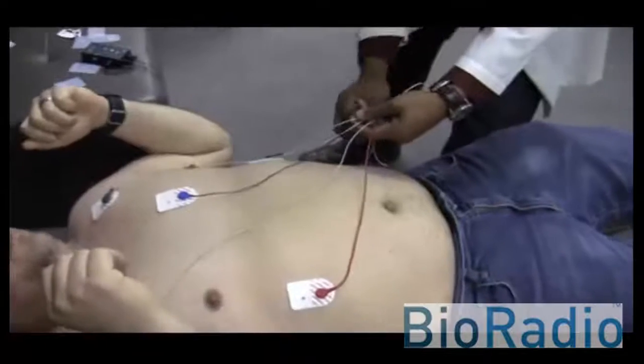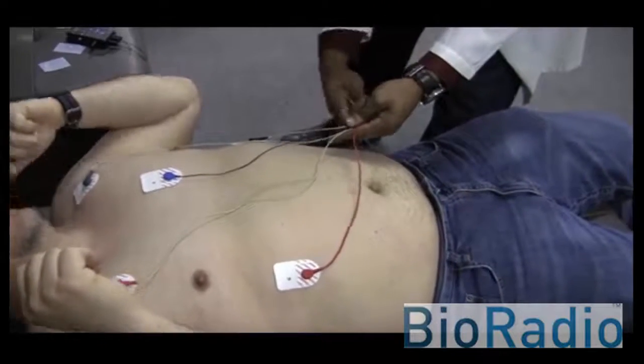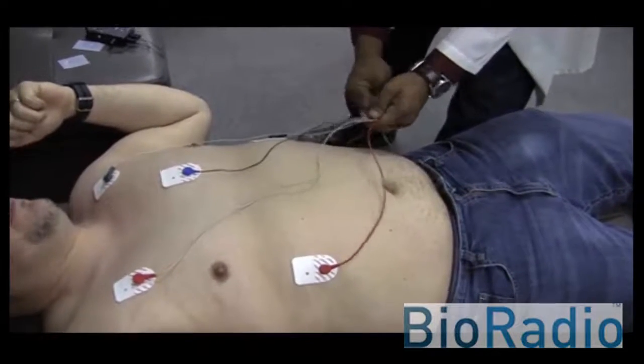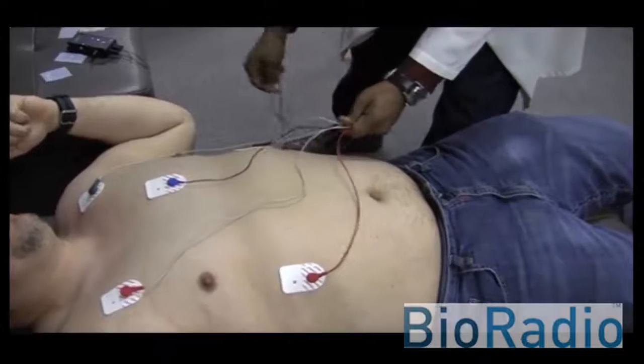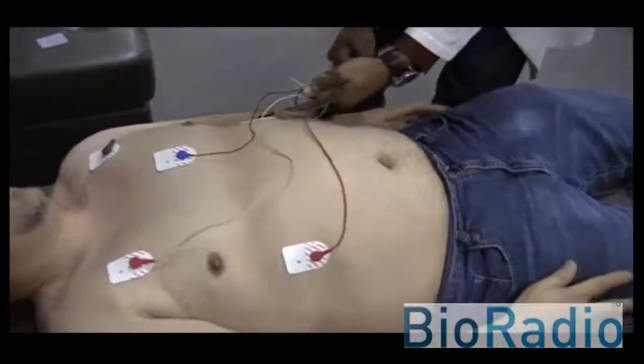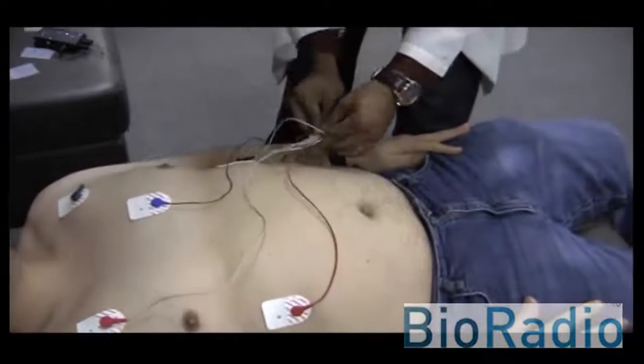The use of surgical tape to take up lead length and to tape down electrodes helps in managing motion artifacts.